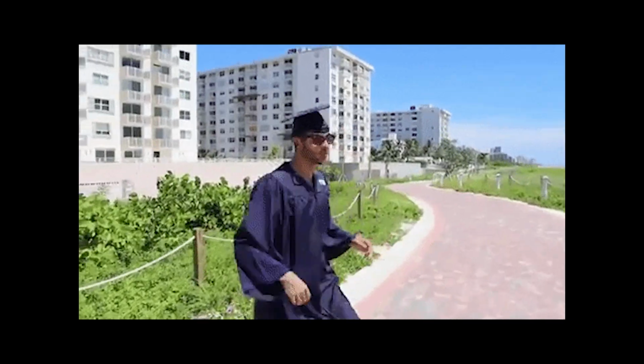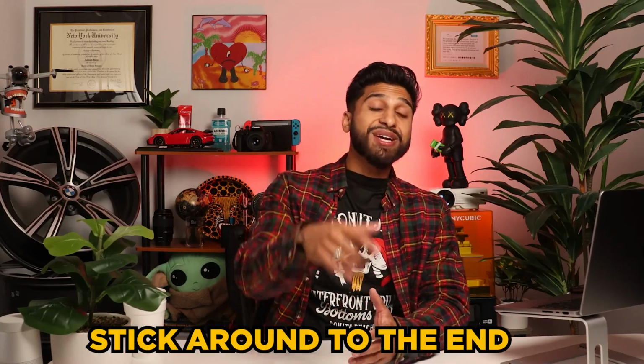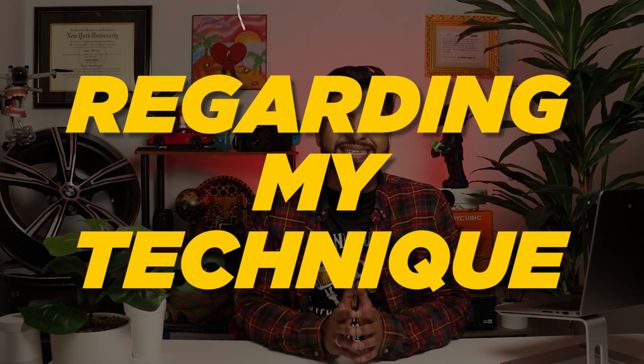If you know anything about dentistry, implants are the hot topic and you gotta know how to take teeth out and graft the sites properly to make sure you have a nice ridge to place that implant in later. Now, I did this case just a few months after graduation from dental school, so there are definitely mistakes I've made along the way, but I've been able to learn from them and hopefully you won't make the same mistakes after watching this video. Make sure you stick around till the end, as I'll be discussing the valuable feedback I received from my periodontist mentor regarding my technique after I showed her this case. Trust me, there is so much to learn from this case, you don't want to miss a specialist perspective on this. Let's jump right into it.